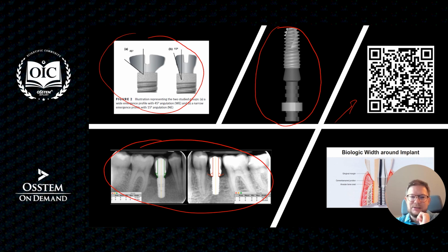Hopefully that will be published soon and available for everyone to check. Anyway, if you scan the code, you can download my presets. It's free, just licensed under Creative Commons, because if someone uses it, I want them to know that I developed that part.